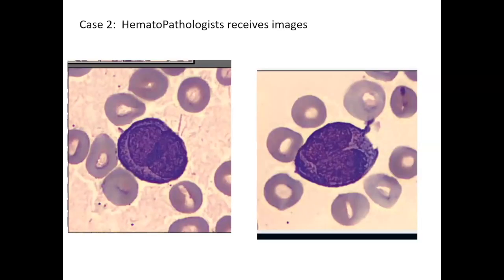Another thing. Somebody sent me across these images. So the pathologists listening to this talk will immediately know this is a spotter, this is an emergency, and you need to urgently communicate to do a FISH for PML RARA. But this is important because the younger pathologists who have just passed out miss these cases because the counts are not very high.